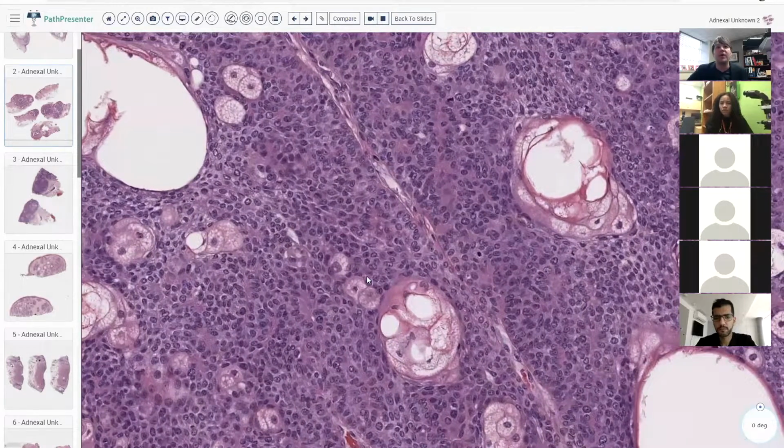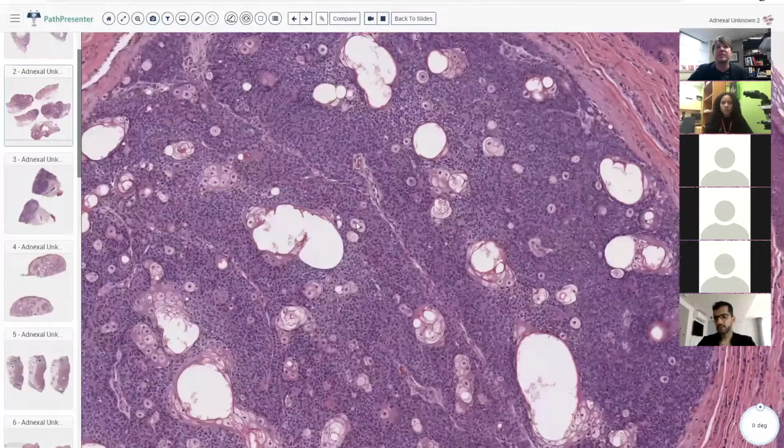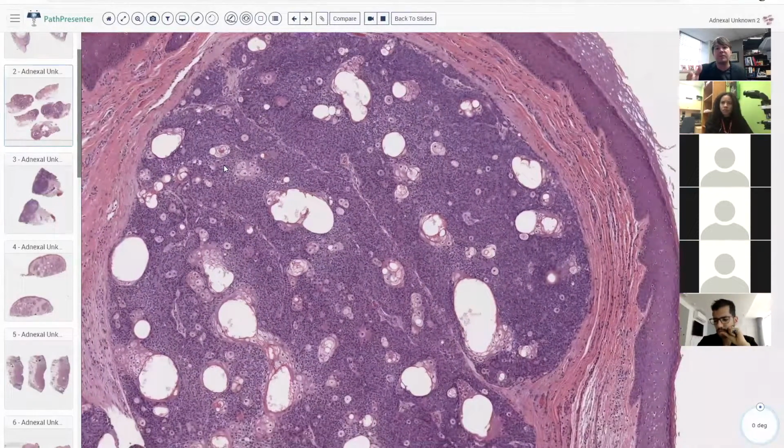I do get worried if I see atypical mitoses, like tripolar mitotic figures, or pleomorphism, or infiltrative invasive growth. Those things are all concerning to me. Okay, so then I will let you guys decide. We've got obvious sebocytes, blue basaloid cells, and the basaloid cells make up the majority of the tumor, more than half of the tumor, whereas the mature sebocytes make up less than half the tumor. So what is the diagnosis?